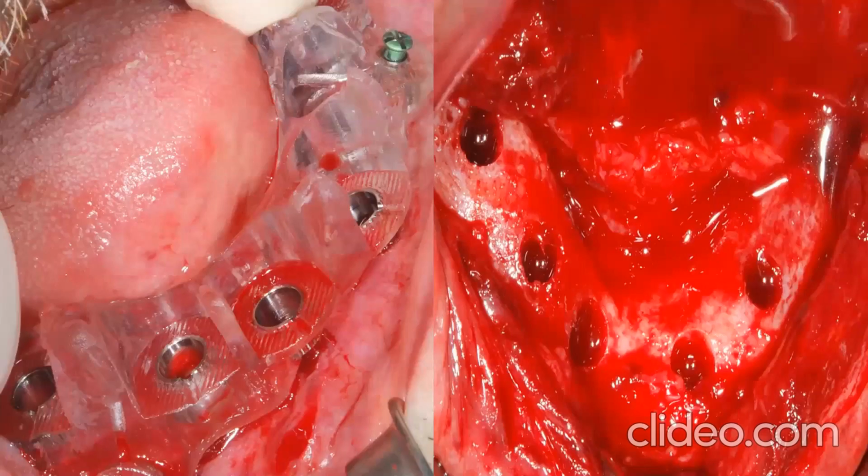So I decided to start with the guided surgery. I put the stent, fixed it with the screws, and started drilling. I felt I was going through air. Basically, I wasn't quite sure whether I was in the bone or outside the bone. But then I decided, well, I'll take it off and open the whole area.